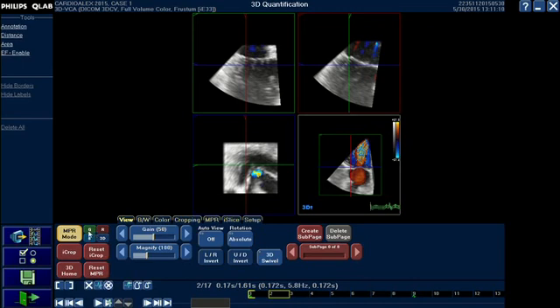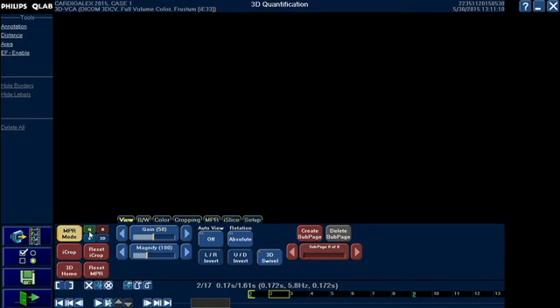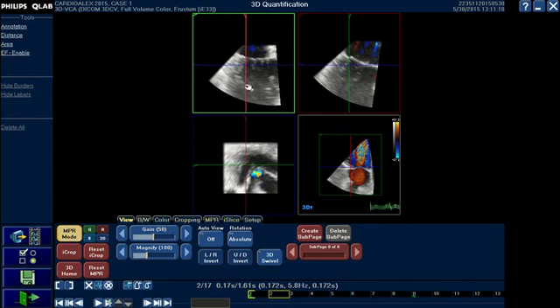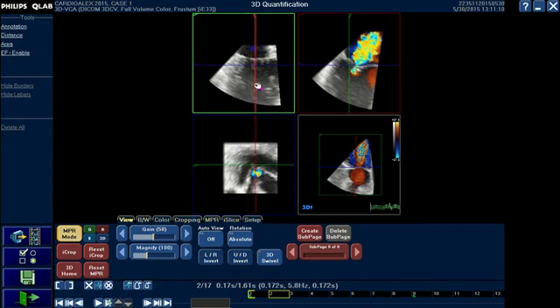If we click the green button, the green frame only will enlarge. Click it back again and we will see all four frames again. Now, since we are assessing mitral regurgitation, we need a systolic frame because mitral regurgitation is a systolic event. So we first have to position our lines at the mitral valve to show the orifice.